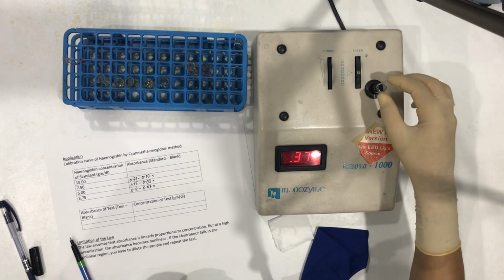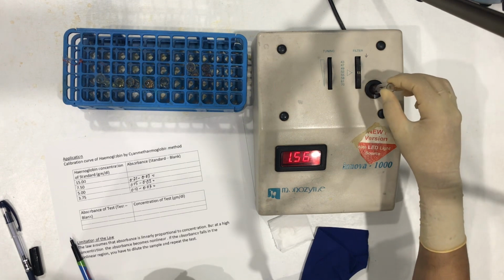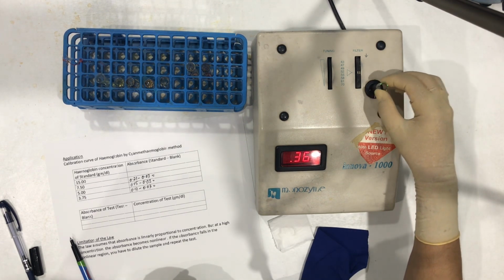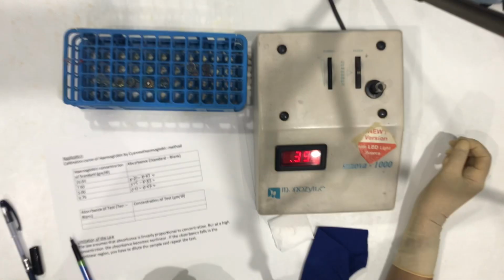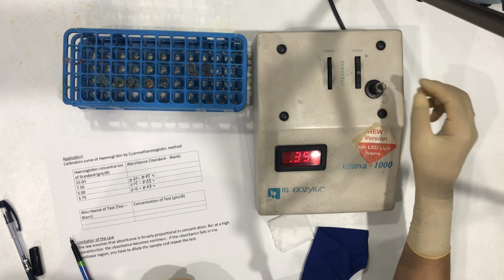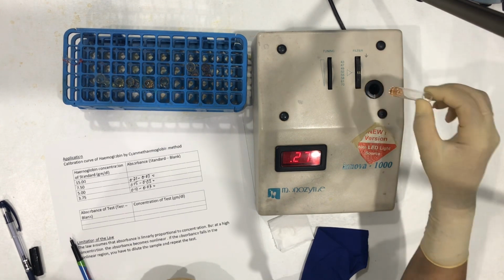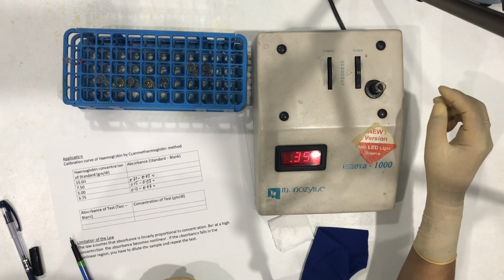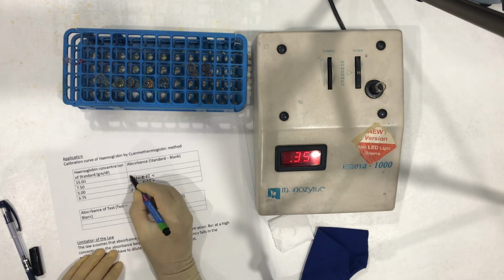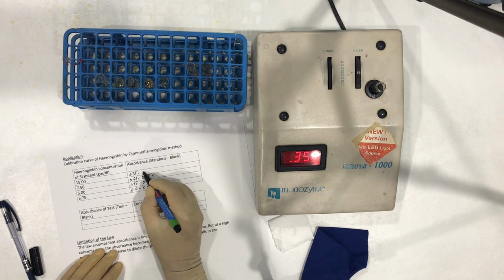Standard 15 is giving the absorbance of 0.35. 0.35 minus standard absorbance of blank 0.03.